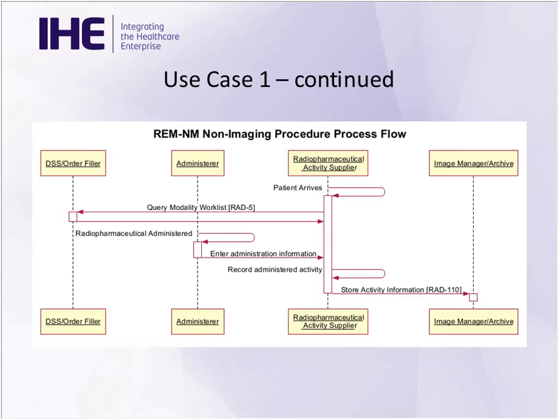scanners when need be. So a lot of times in nuclear medicine, there's an uptake time for the radiopharmaceutical. The radiopharmaceutical is administered, well, in this case, this is non-imaging, so it's just going to go to the archive, and we'll have an example and a billing that something happened to a patient in the nuclear medicine department. And it also could flow down to the dose information collector when it pulls from the archive.